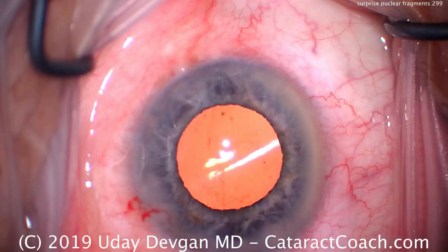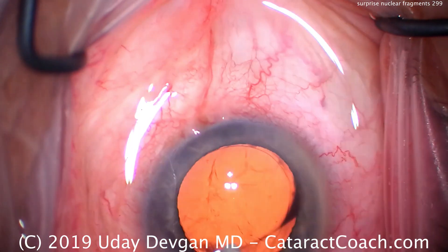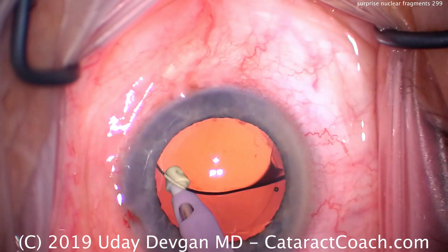Lens centers nicely. I'm sure it's totally in the capsular bag, and now it's time for our irrigation aspiration. I use a high flow rate here — I like at least 50, preferably 60 cc's a minute.